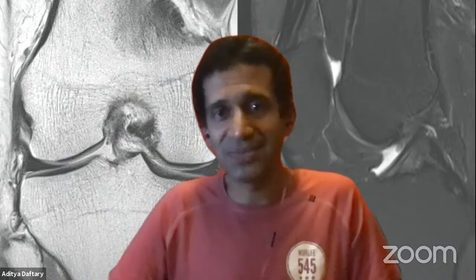I think some people have thought about using dynamic imaging for seeing if there's dynamic meniscal extrusion. Honestly, something that I have pushed in our practice for the longest time, but we never really had the big need to do it, is that you can even look at these things with ultrasound. You can have somebody lying down, look at their meniscus, and then have them standing up and see if it extrudes more. So you can use these things. These are the 2 big reasons I can see for using dynamic imaging.